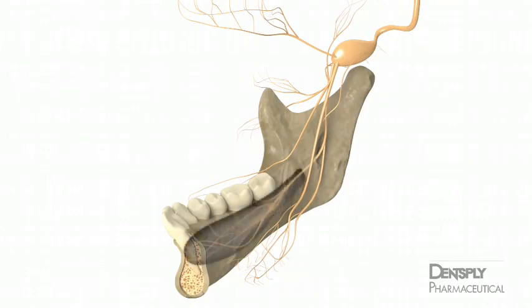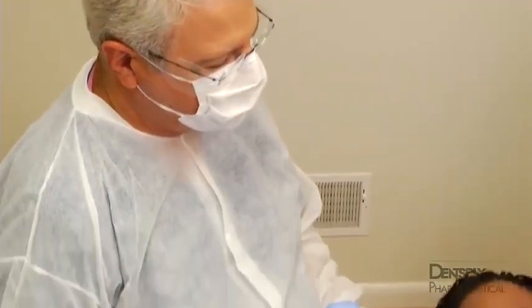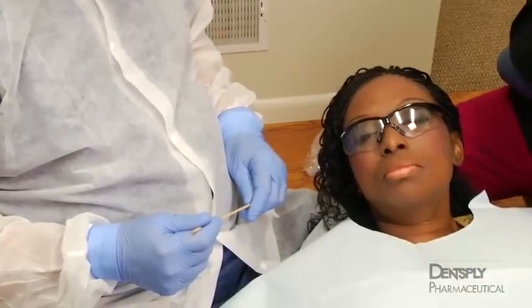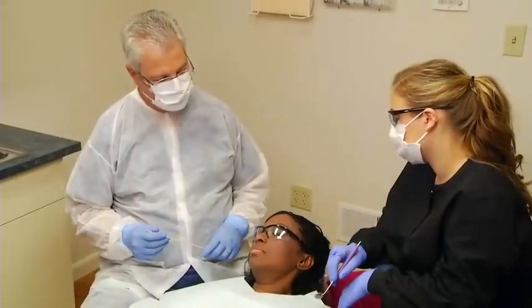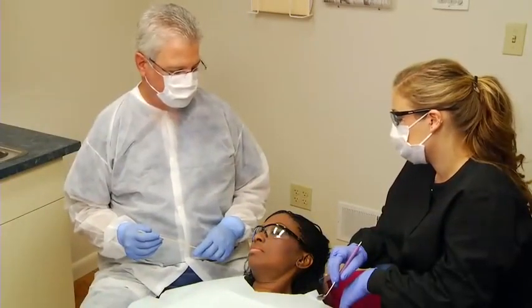In addition to the inferior alveolar and lingual nerves, the buccal and auriculotemporal nerves are often blocked, the buccal nerve approximately 70% of the time. The position of the operator and patient for performing a Gow-Gates block of the left mandible is similar to that used for the standard inferior alveolar nerve block, except that the clinician must be able to view the patient's face, in addition to the oral cavity.